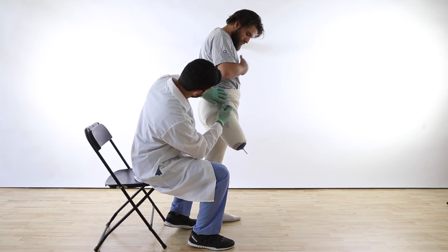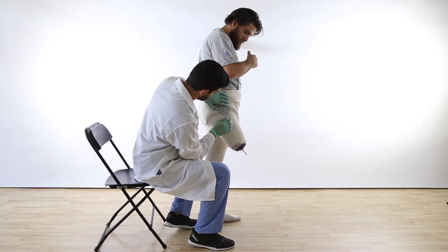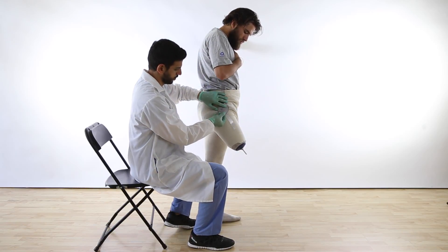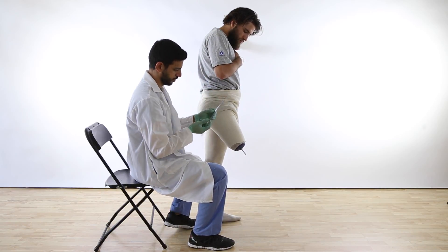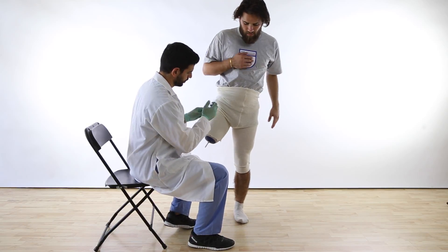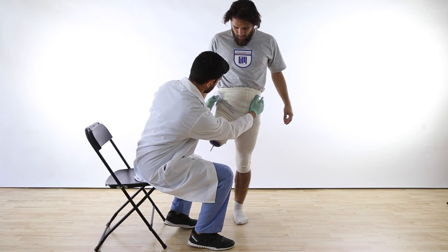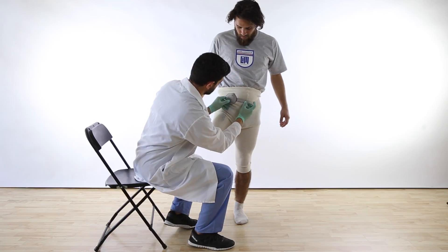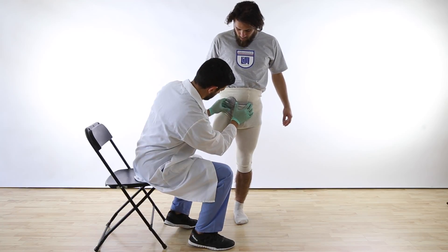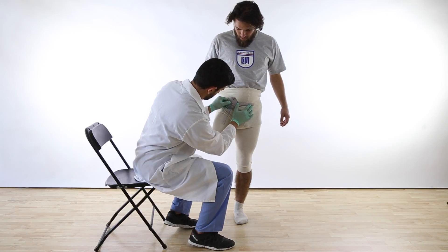Once measurements are done, use a goniometer to get your flexion and adduction angle. This can be done in supine or standing position. For adduction, from the coronal plane, the static arm sits leveled at the pelvis and the mobile arm bisects the femur, also measured at resting position. On the order form, put in your final requested flexion and adduction angle.